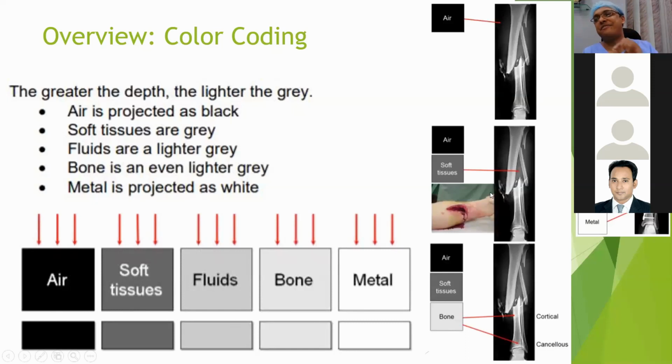Now this is a very, very beautiful picture on your right. This helps me memorize it, and I essentially never forget this picture. This helps me decipher if I am confused with an X-ray. I just remember this picture and it helps me understand what I am looking for.